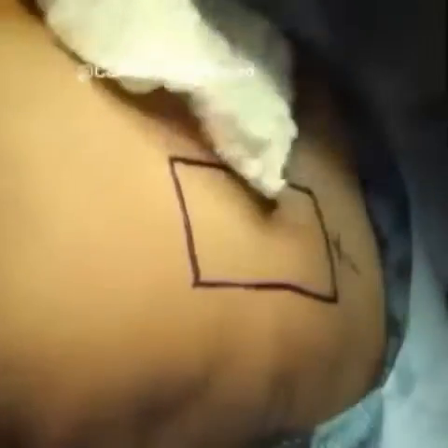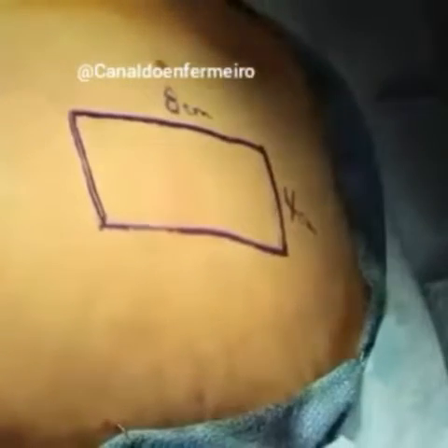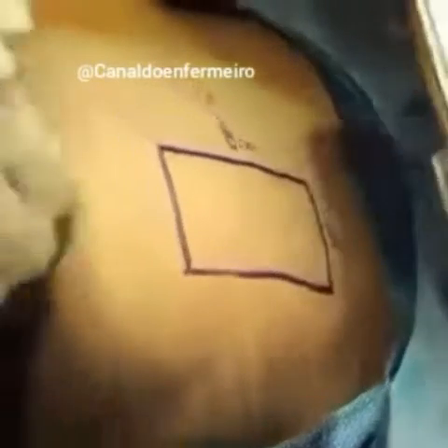The area is then covered with mineral oil, which serves as a lubricant between the blade and the skin. Tension is applied across the wound in order to facilitate graft harvesting.